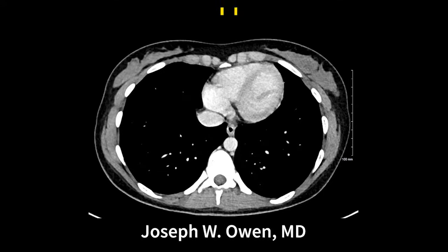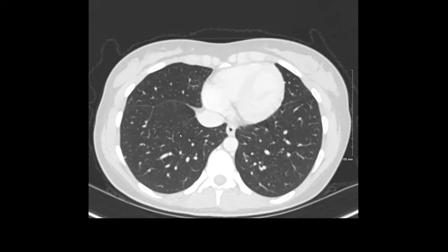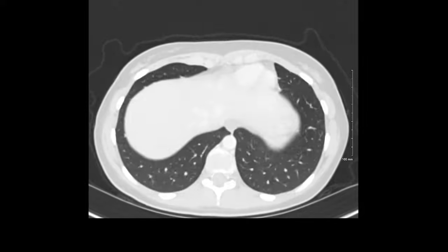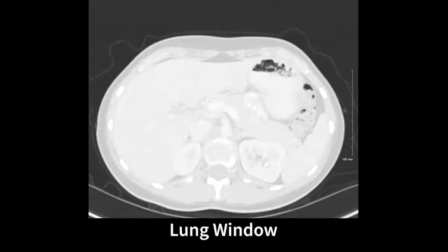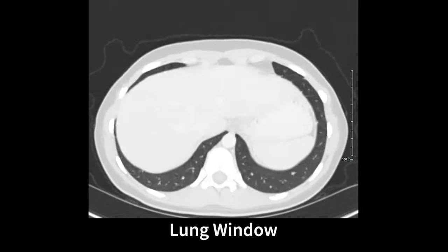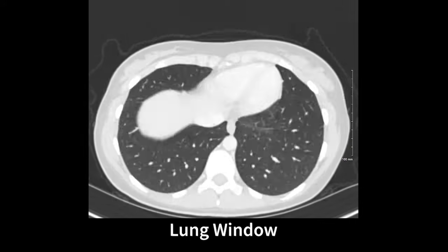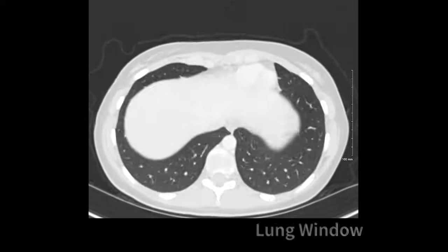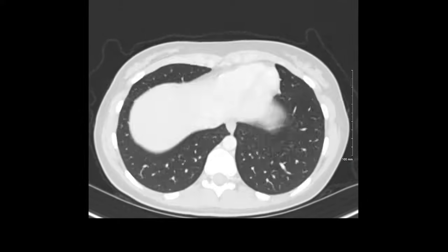When I start with a CT abdomen and pelvis, I will begin in the lungs and I think about dividing the lungs into four quadrants. I'll look at the anterior right lung and the posterior right lung, the anterior left lung, and the posterior left lung. Notice that we are in a lung window that gives us good resolution of air spaces.